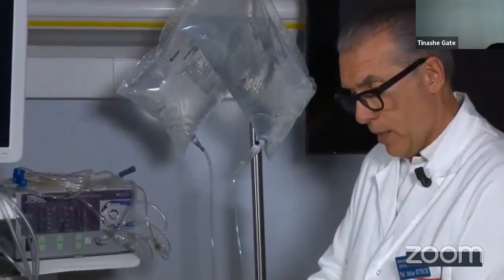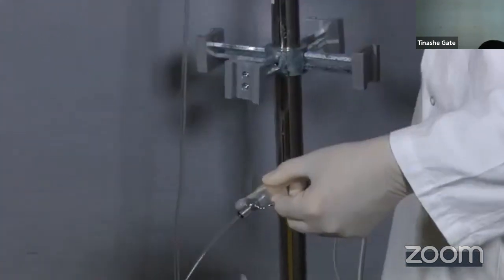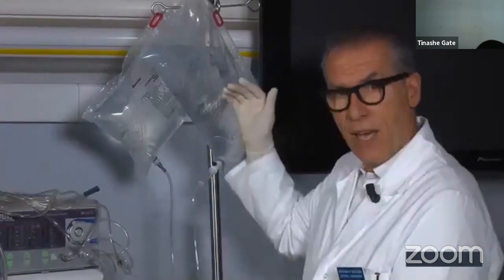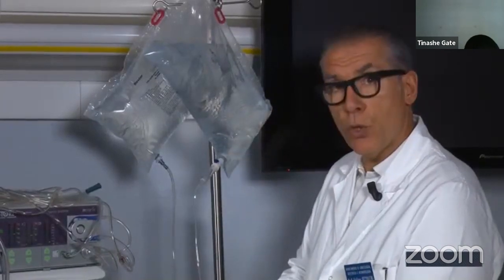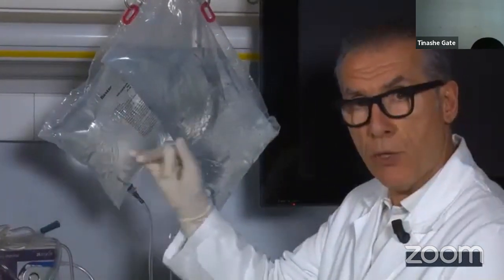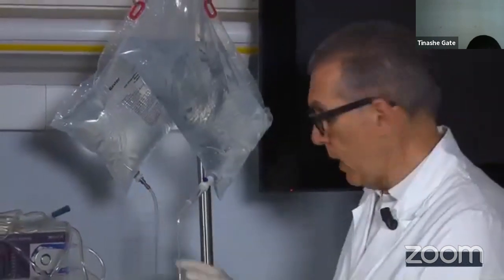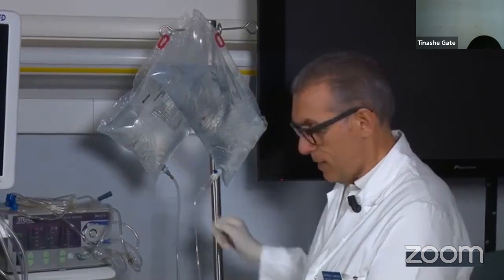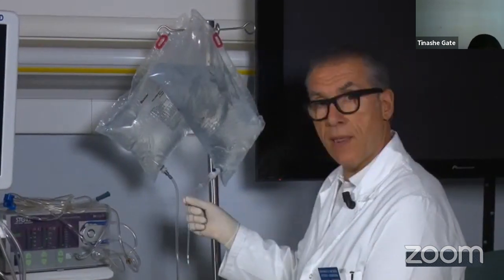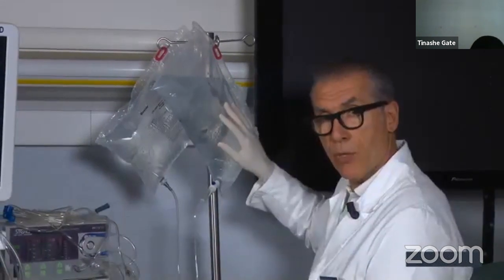If for some reason I close the endovenous system and let the other one go out, at a certain point the amount of liquid in the sac will change. Changing the amount of liquid in the sac, the gravity pressure will also change. So we will have two different flows: one generated by this amount of liquid, much more than this, and this one much more reduced. This means that at a certain point, if I empty the sac connected to the large silicone tube, I will get the same flow I would have using this filled sac connected with the thin silicone tube, only because the gravity pressure of the liquid acts as an extra pressure, an extra flow.